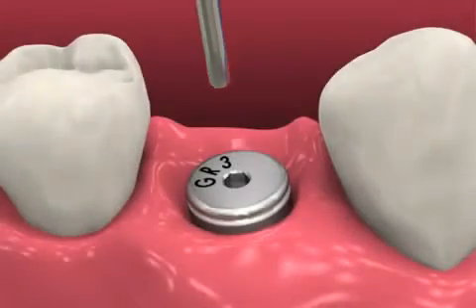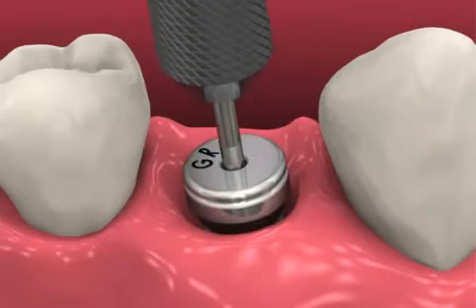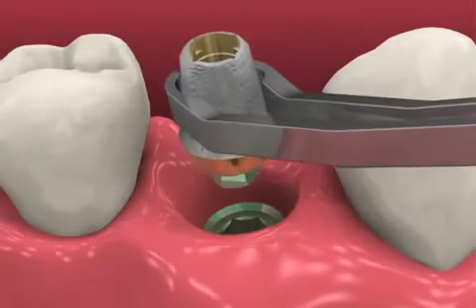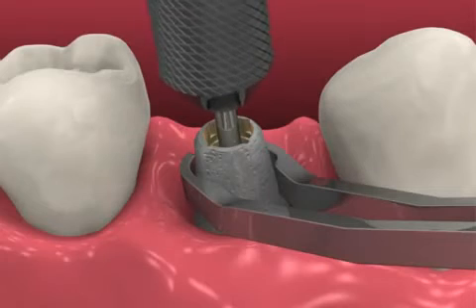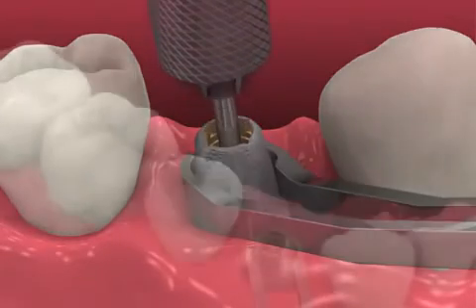At the second restorative visit, remove the healing abutment or provisional prosthesis and irrigate the prosthetic platform to remove any debris and dry thoroughly. Seat the prepared abutment in the patient, being certain to maintain the same orientation as was found on the model. Hand tighten the abutment screw with the 050 hex driver and radiographically verify complete abutment seating.